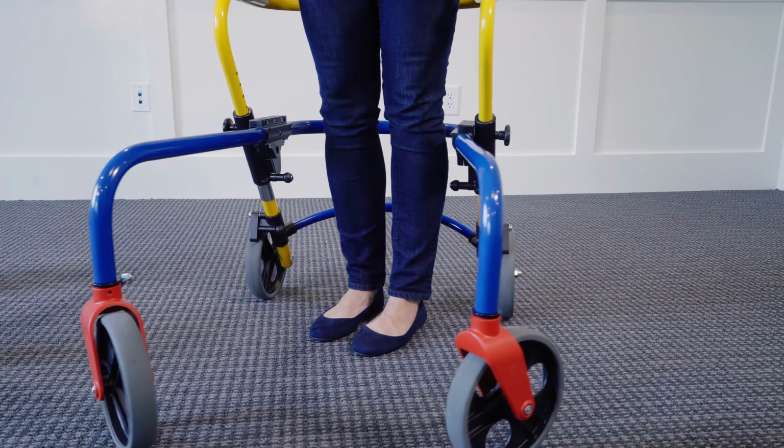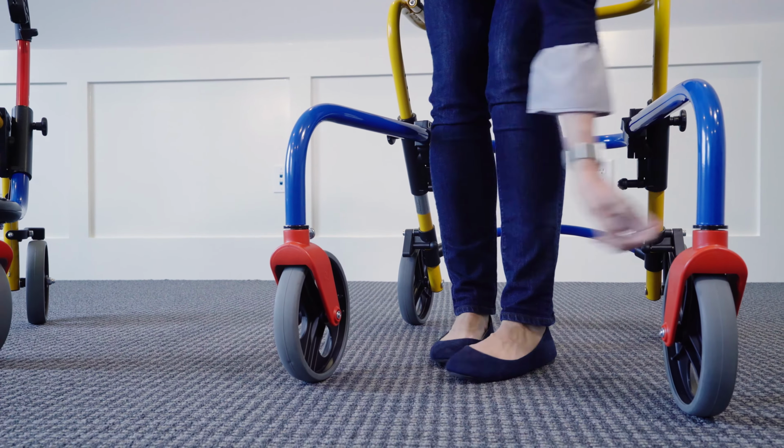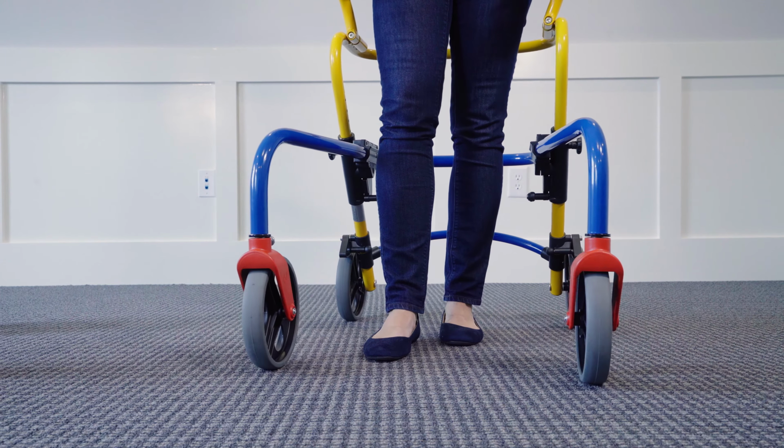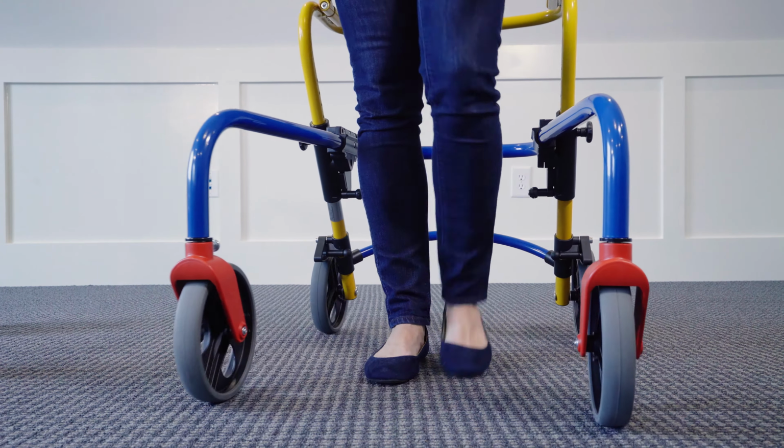Most children that have CP, they want that freedom, but some kids that you may see have ataxia, so you'd want to drop that pin back down into there. So now that decreases the degrees of freedom, so they have more control. They can only go straight.